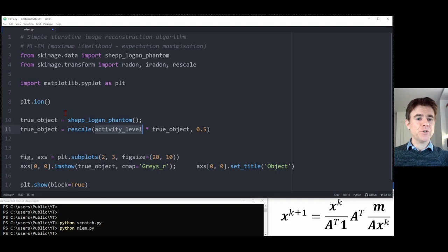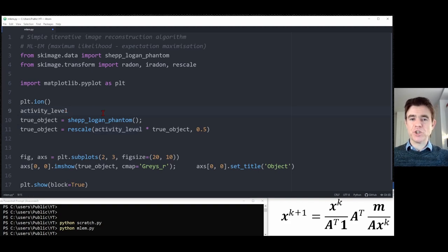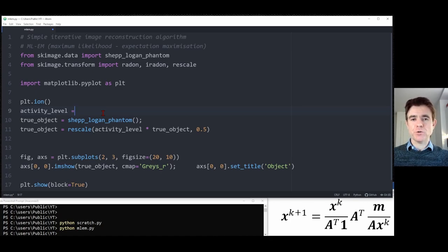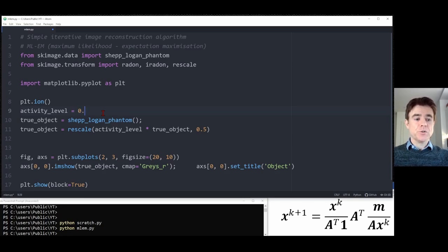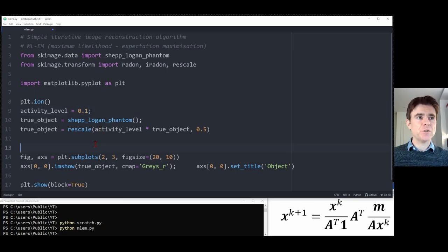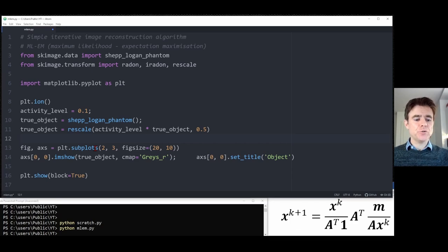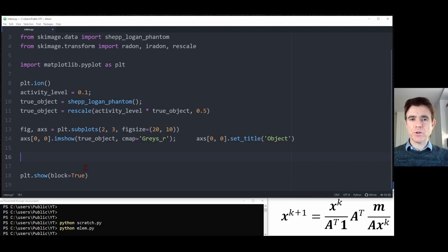We'll also set an activity level, just changing the amplitude of the phantom — effectively controlling the radioactive concentration if this were a simulation of a PET scanner acquisition. That scaling factor is not strictly necessary to demonstrate what's going on here. Now that we have the true object, what we're going to do is forward project it to generate simulated sinogram data.